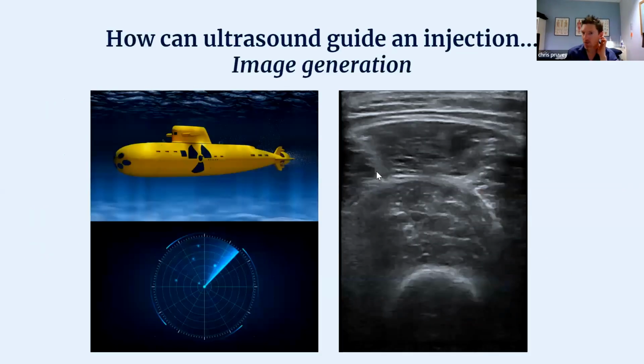So I just want to go through this as well. This is important before we come on to the actual injections. There's a reason why I've got this. So what have the left-hand pictures got to do with this? This is my quadriceps muscle. This part here is my rectus femoris, and this is the one underneath, my vastus intermedius. This is the bone here.